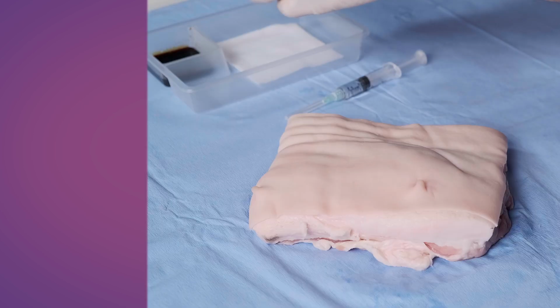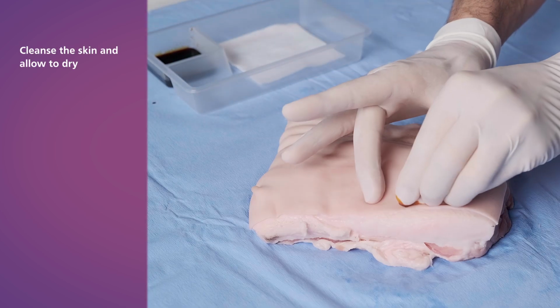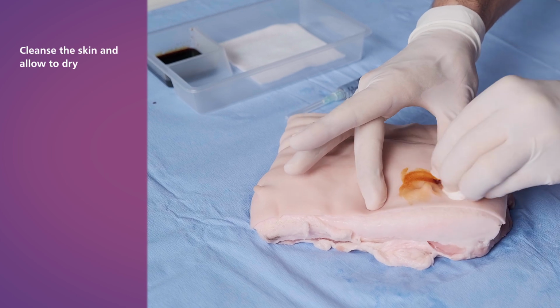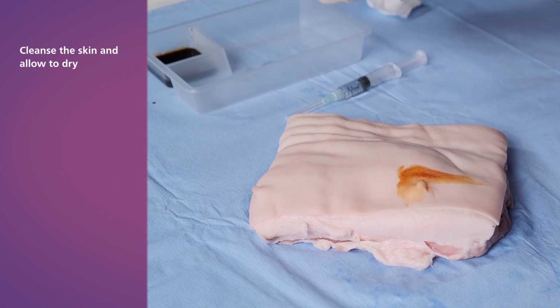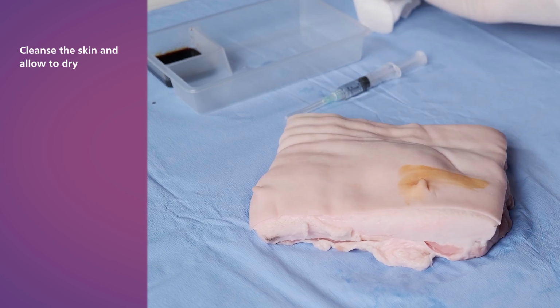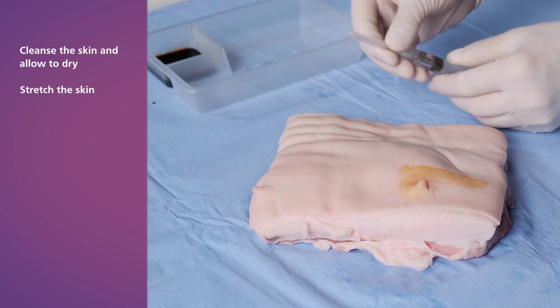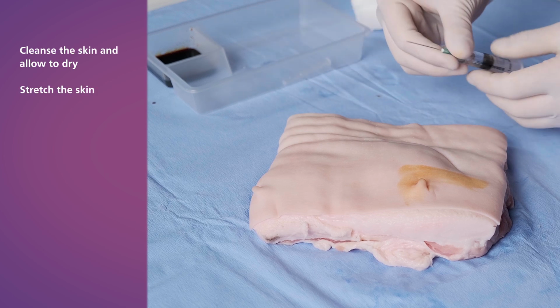If appropriate, mark the intended injection site using a surgical marker. Cleanse the skin with appropriate antiseptic, allowing it to dry to reduce stinging on injection. Hold the syringe in your dominant hand and gently stretch the skin with your non-dominant hand.